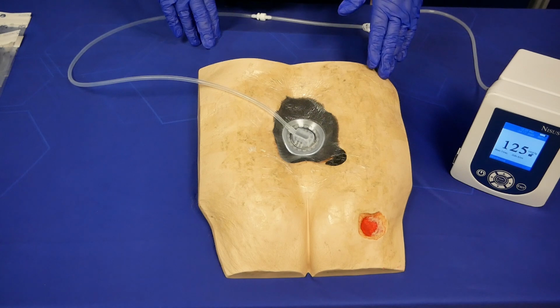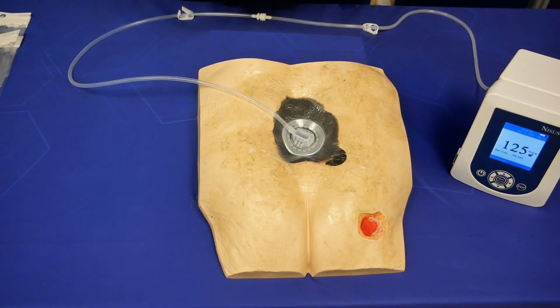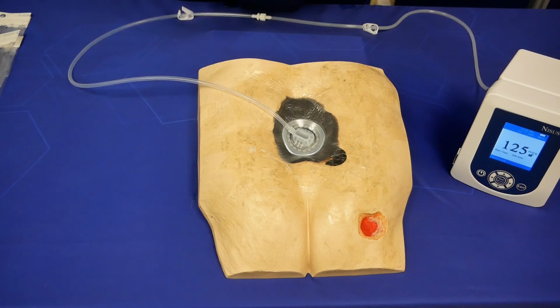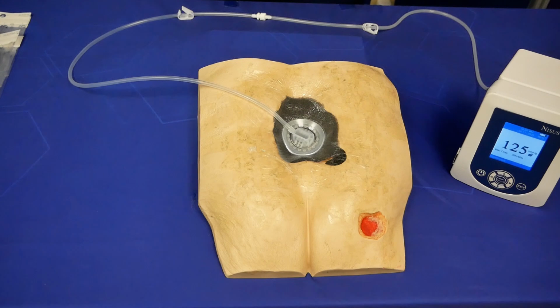Now this dressing was applied to a coccygeal wound. If this was a real patient, we would want to bridge this away. This is completely appropriate for any other part of the body, but since it's a pressure area, we always like to move that port pad to someplace more comfortable, and we're less likely to have any damage to the pressure area that you're trying to treat and heal. And so we'll show you what that bridge looks like now.